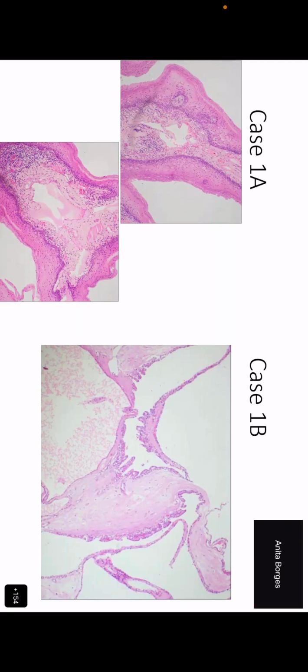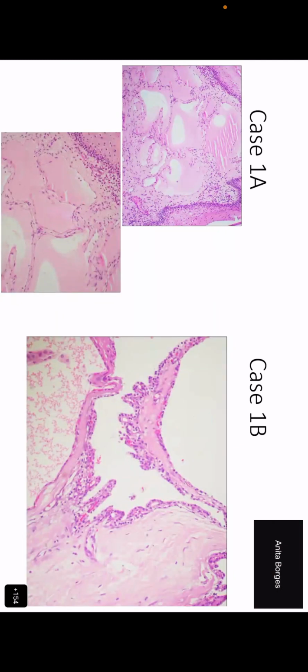1A also, I think it is an epithelial lining. 1A also you thought was an epithelial lining. Suveta, if you thought that 1A was an epithelial lining, then why do you say that that was not a secretion? You agreed it was not a secretion. If you have an epithelial lining and you have something inside of it which is pale or completely pink, why did you say it was not a secretion then? There's something contradictory about it, right? Yes, ma'am. Now you can see the thing at higher power.